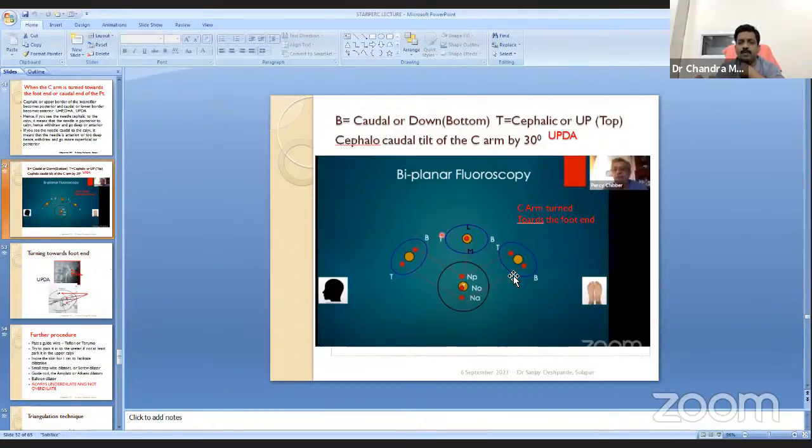I don't want to confuse. Correct. Because I am doing supine PCNL now regularly, it is like left hand driving and right hand driving. Suddenly you feel a little uncomfortable when you drive on the left hand side while sitting in another country. So you have to be careful. The best thing is to assess the needle movement. The ultimate aim is to go towards the stone or calyx.